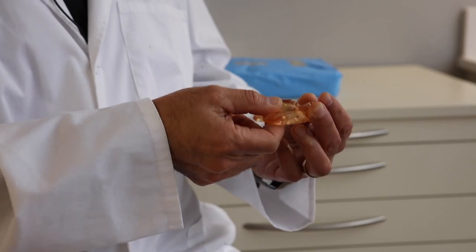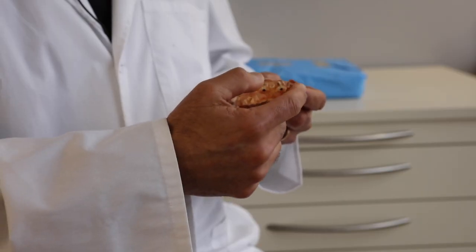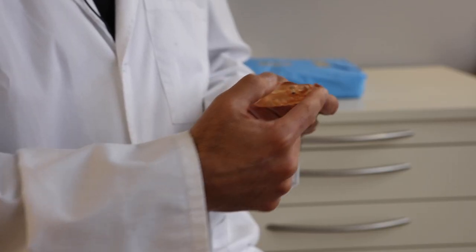The first step is to insert the duplicate denture guide into the patient's mouth. Once it's stabilized by having the patient bite down very gently, you can make your osteotomies through the bone to find your reference points. This is what allows you to prosthetically place your implants in reference to where the teeth actually need to be.